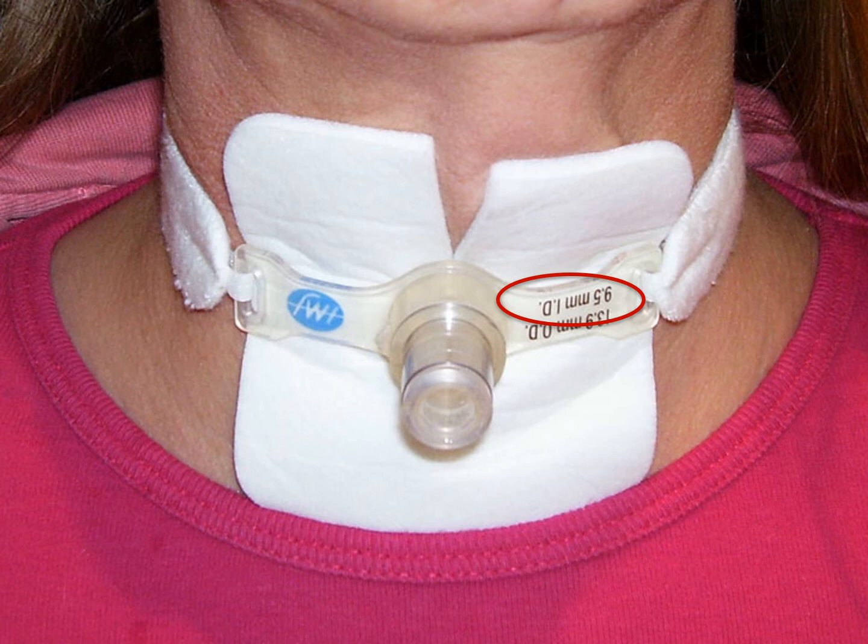So for safety reasons, changing the ties and doing the dressing is a 2-person technique. One person holds the tube and the other visually assesses for redness, swelling, purulence, any signs of infection, and if you see one, please do take a swab. But also how much drainage there is around the stoma itself, if there's any secretions that have pooled and are leaking around it. This can be a problem with humidification. But if the skin does look irritated, then barrier cream can be applied.